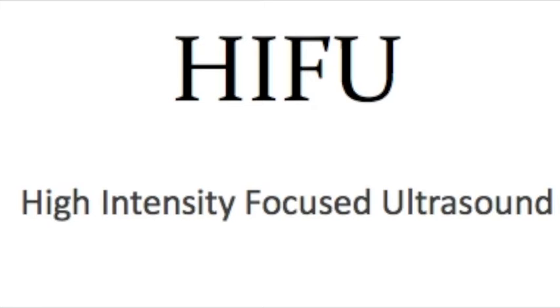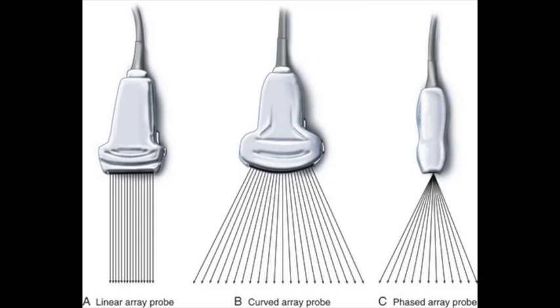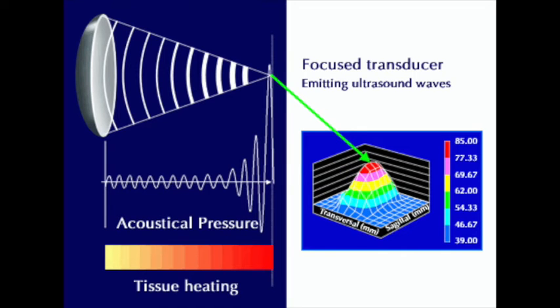So what is HIFU? HIFU stands for High Intensity Focused Ultrasound. In the medical field, we use low-intensity, non-focused ultrasound to perform body imaging such as abdominal and OB ultrasounds. When we look at ultrasound probes used in body imaging, the ultrasound waves go away from the probe in a linear or a divergent fashion, and they're low energy. In contrast, HIFU generates high-intensity ultrasound waves, and these waves are focused onto a very small focal area.